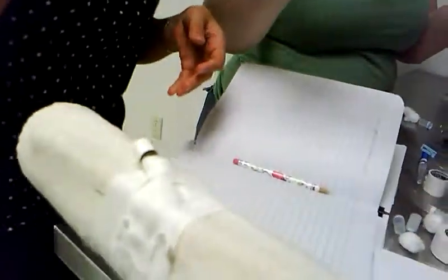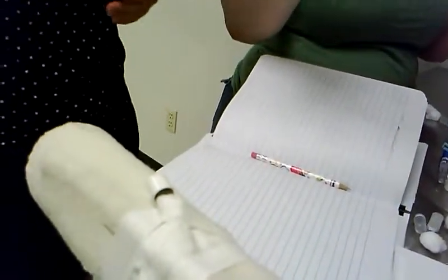Remember the distal limb — the feet. What are you worried about? You just did it perfect. So up here, now you have two angles.